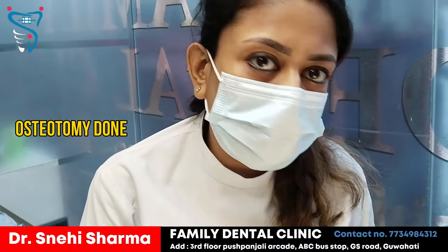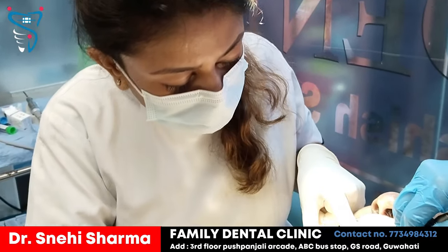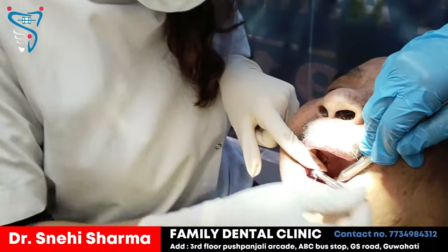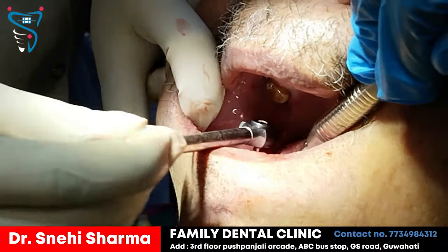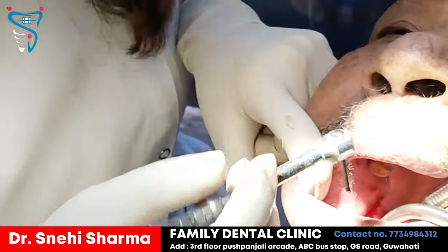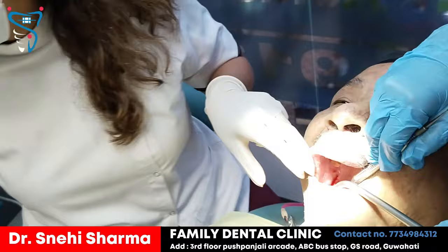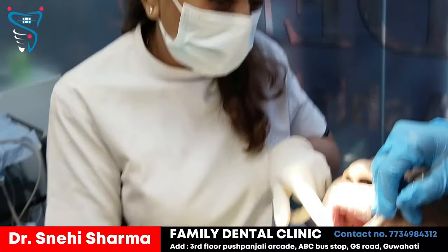Now we're going to place the implants within the osteotomies that we've created. We'll put the implant into position, achieving a nice primary stability. There goes the first implant inside. After the implant is placed, I'll put in a cover screw to cover the implant.